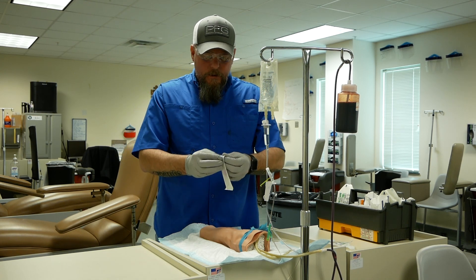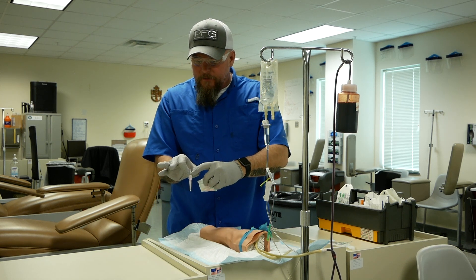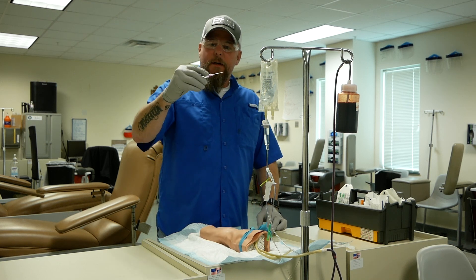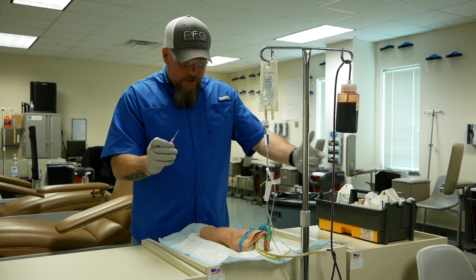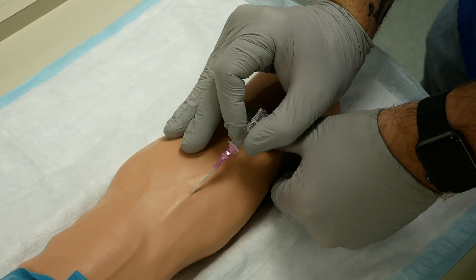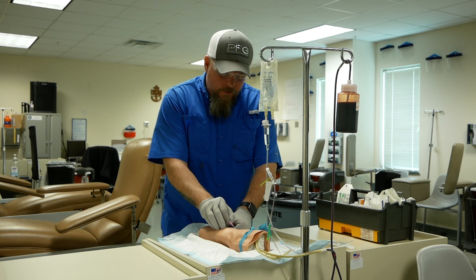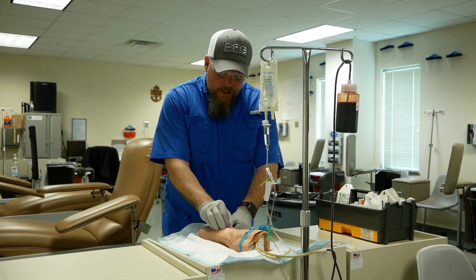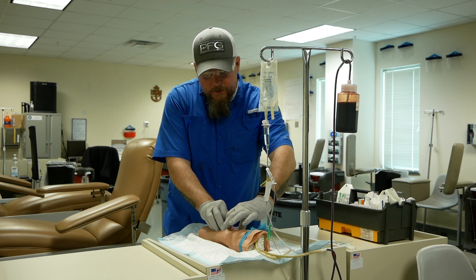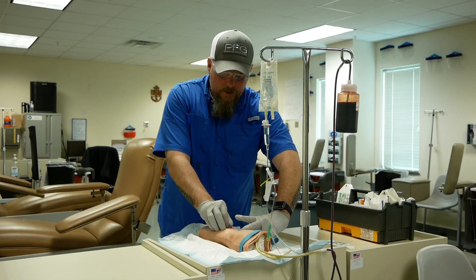While it's drying, open your needle. This clear plastic is the only part you're holding on to and today we're going to hold it on the side so we can see the flash chamber. Take your cap off and throw it in the trash. Ensure that your bevel is facing up — there's a notch here that demonstrates that, but always make sure. Come three to four inches below the site, go in at 15 to 30 degrees, and insert the needle until you observe flashback. You can see blood coming in there — that tells you to stop advancing the needle. Once we get flashback, lower it almost flush to the skin and advance it one half to one centimeter. Now slide the catheter off the needle into the arm. Let go of the catheter, continue up the arm, and release the tourniquet. Come back down the arm, occlude the blood vessel with your middle finger, and stabilize the catheter with your index finger.